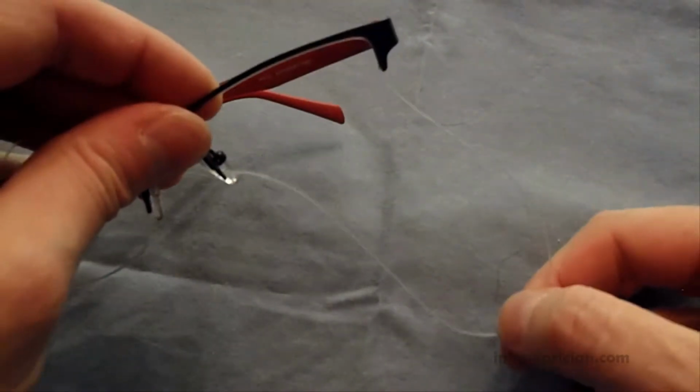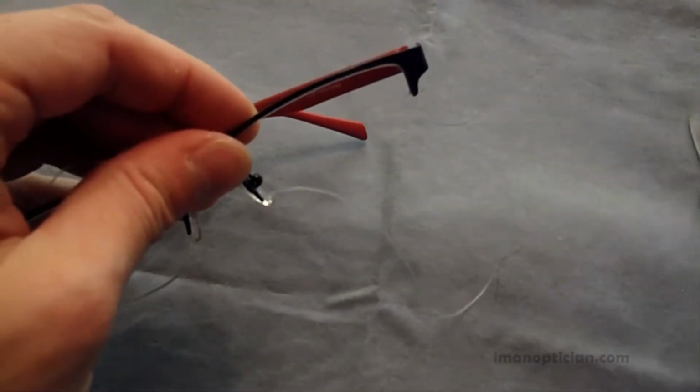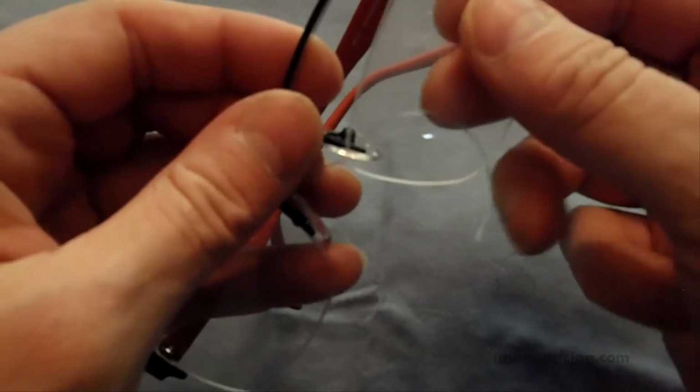Now we've got quite a large sized eye wire here. It's quite big, and that's okay. Just leave it big like that for now. We're going to put our lens in.